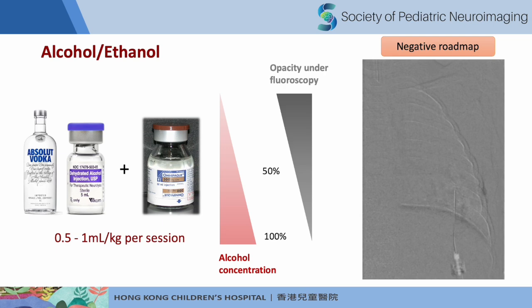And it's important not to inject more than you have injected for the venogram, because with pressure, the alcohol can extravasate into different spaces and cause surrounding injury. So your goal is to fill up that venous malformation, but not overdo it.